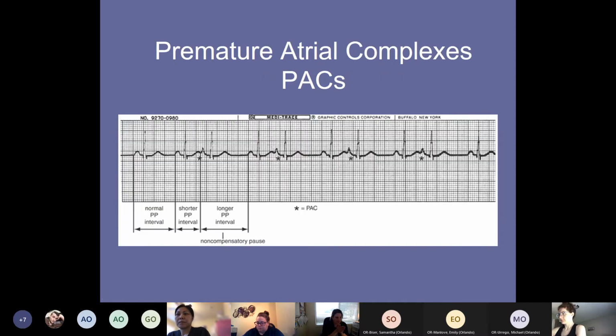All right, so I want to stop here and talk. We've talked about rhythms so far. There are EKG or ECG rhythms, but then there's also features. Did Dr. Haylett talk about features with you guys? A little bit. Okay, so I want to stay on this for just a second.